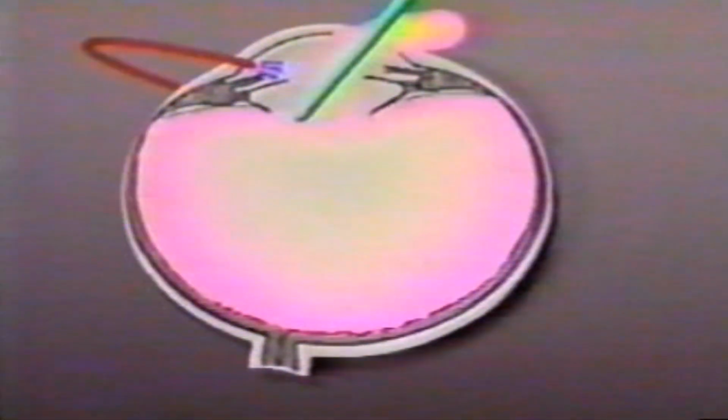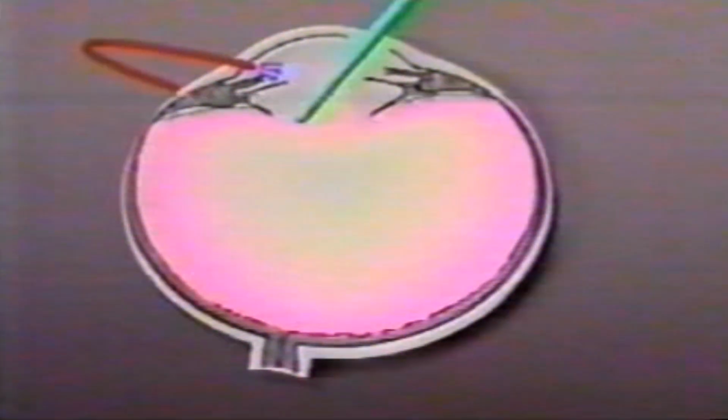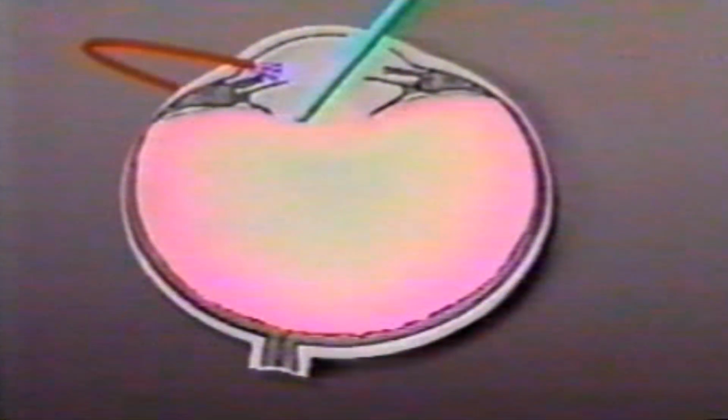In this animation, you can see the vitreous acts like a slinky. When there is a posterior capsule rupture and a coaxial irrigation aspiration, which means that irrigation and aspiration are the same port, there can be an extension or enlargement of the posterior capsule rupture and more hydration of the vitreous, and more vitreous will start coming into the anterior chamber.